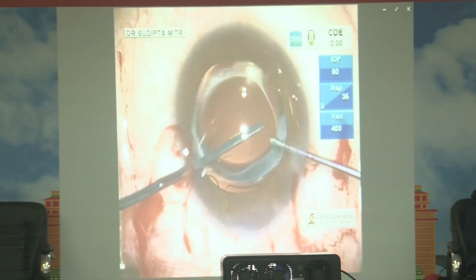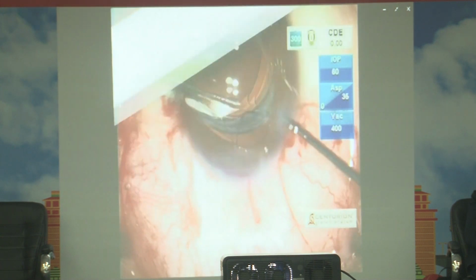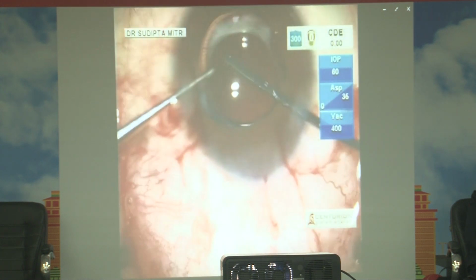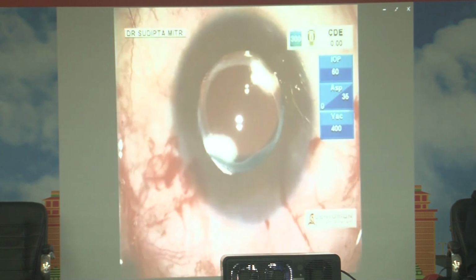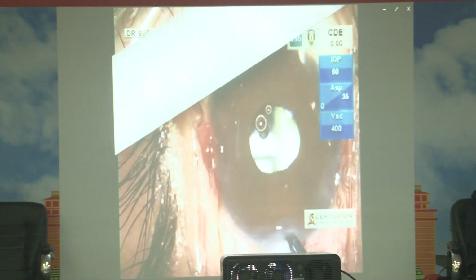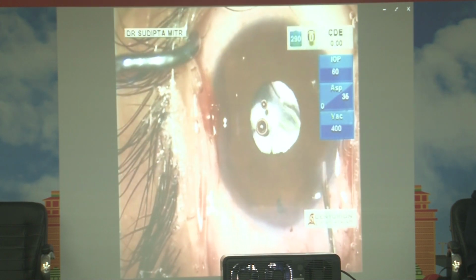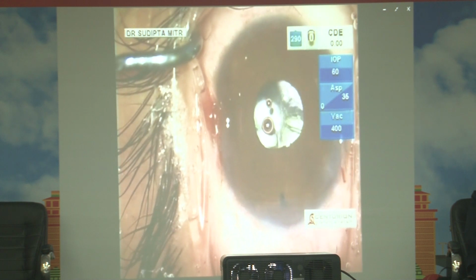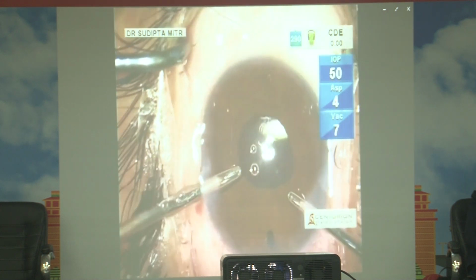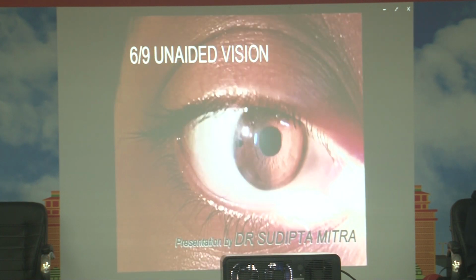It's very difficult to take it out because the bag cannot tolerate 2 IOLs at a time, and especially a fibrous bag. This is fibrous because I waited for pretty long time to find out the change of refractive error, and until it stabilized, we did not do the case. It's better to do a peripheral iridectomy since you have 2 IOLs, and do a thorough AC wash in between the lenses. The viscoelastics create problems. And this patient ended up quite well with a good result, AC depth and good vision.